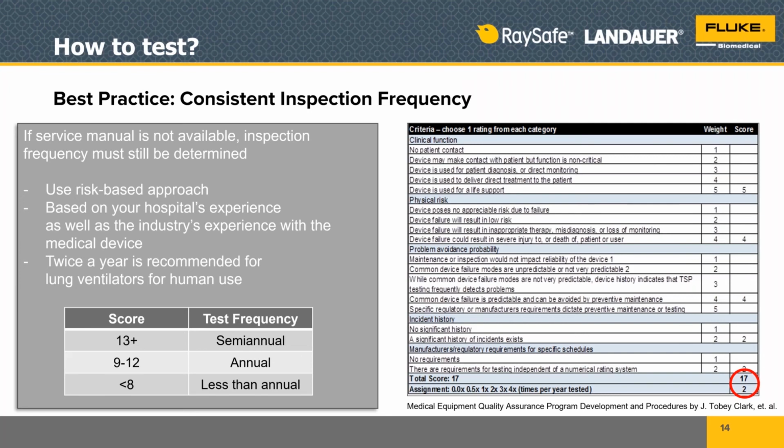Sometimes it doesn't state it at all. So if it's not stated, the test frequency, then you might as well start here and then adjust going forward. But this is a really good starting point.